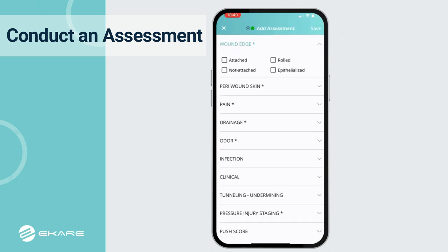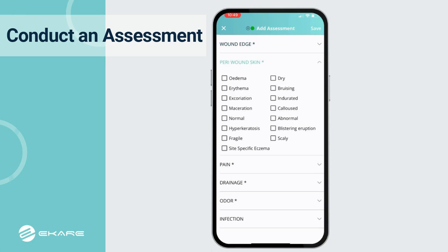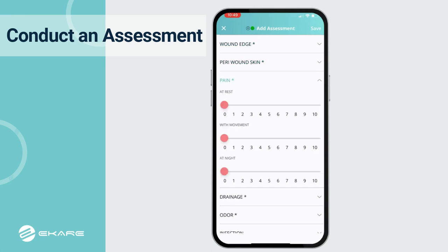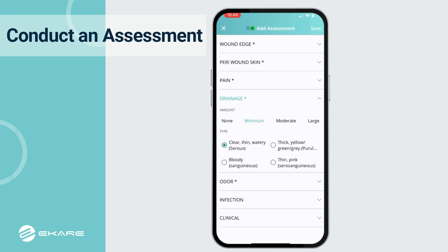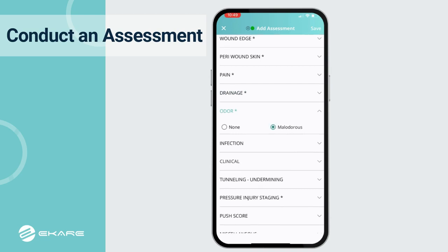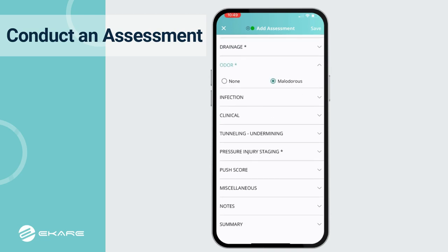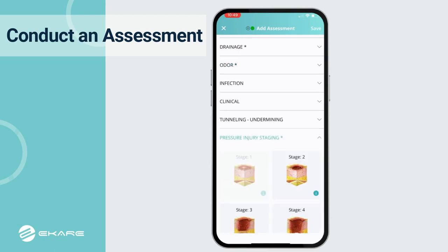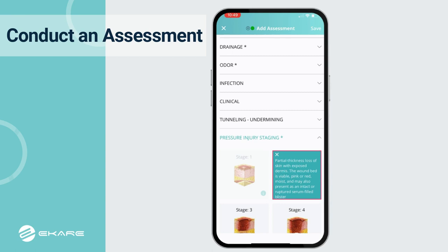The user can document wound information such as details on the wound edge, peri wound skin, pain level, drainage amount and type, presence of odor, and pressure injury staging with visual and text descriptions to help properly stage the wound.